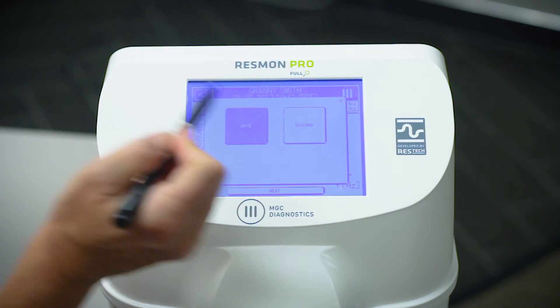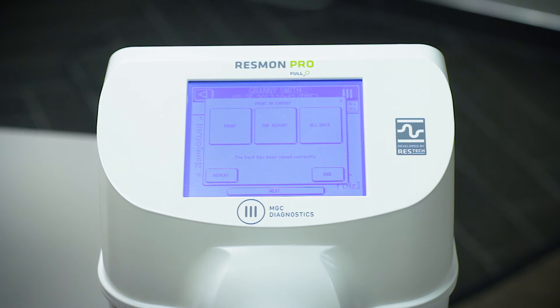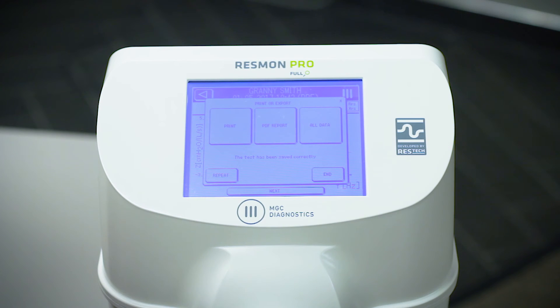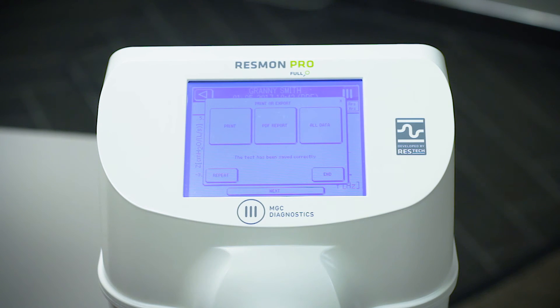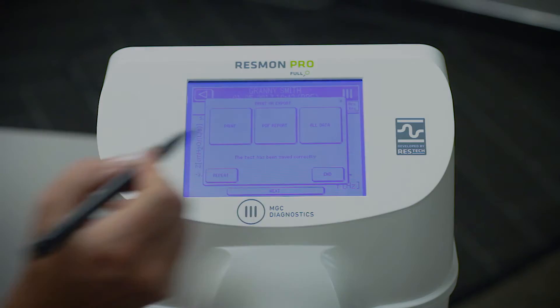I want to save my data. The PDF report can be saved on a USB memory stick, or if a compatible printer is connected, then you may print it directly from the device.